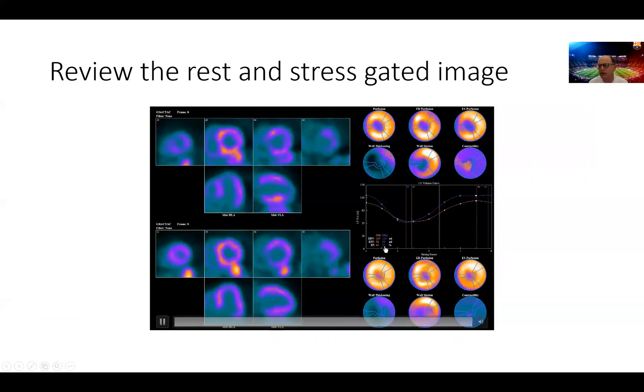The second observation is this left ventricular dilatation post stress where you can see the systolic volume and diastolic volume going up and the left ventricular systolic function going down from 52 percent at rest to 44 percent post stress. These are again all prognostic signs that we should report when we go to the interpretation of the test later.